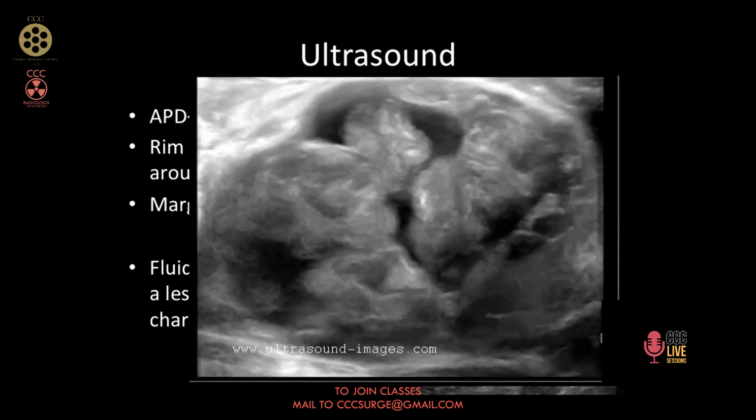Thank you very much. Now, as I said, cystic lesions, I mean cysts with fluid within, can be due to various reasons. Number one, I will show you the next picture, what a cyst and a solid thing can look like. That's a separate thing. Number two, there can be a cystic degeneration, but a cleft is something like this. So it's like a small cleavage within a lesion. And if you find these lesions, this is in one view, but in the other view, this will look like this. So this is a cleft, whereas a cystic lesion will either be a uniform cyst, which we'll show next, or it can be a cystic degeneration in malignancy, in which case the clefts are not there. It is a clear-cut space, defined, dilated, saccular space. Okay?